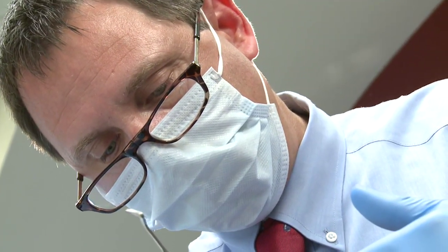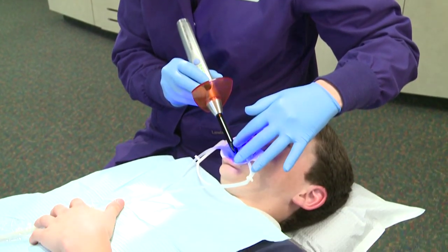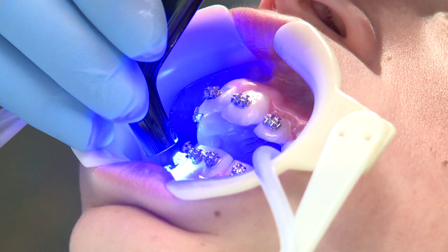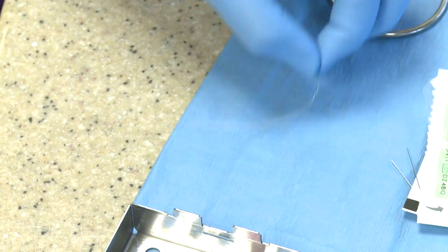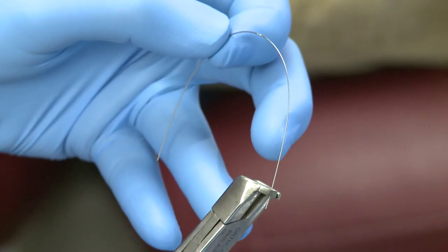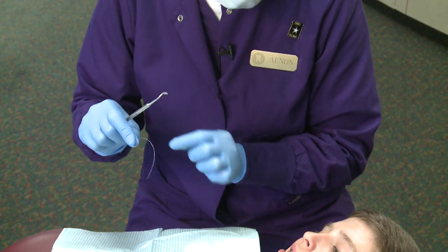After the brackets have been properly positioned on each tooth, the glue is cured with our special light. Once all the braces are on the teeth, we place the wires into the brackets. It's actually the wire that does most of the work — as the wire starts to return to its normal arch shape, the teeth are moved into their position.